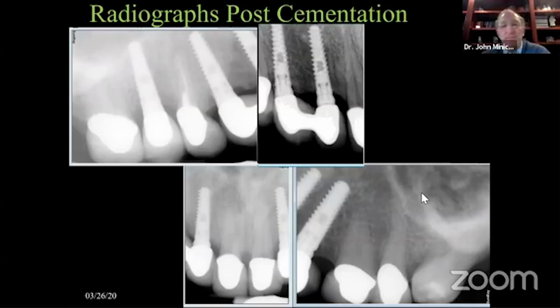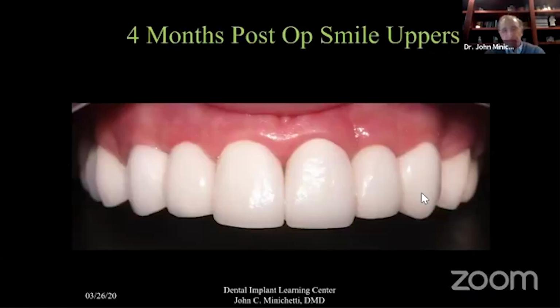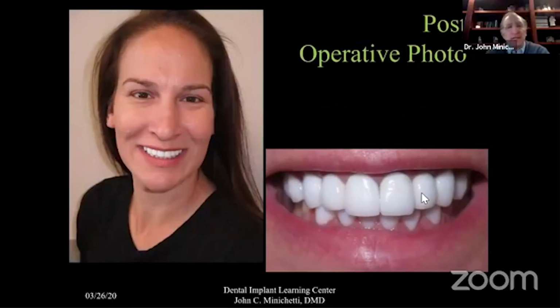And we use cementable crowns on these abutments. And there's a final outlook probably a few months later, 4 months later. And that's the final prosthetic result. And to be honest, the cost of this treatment ended up being a little bit more than what her husband's was, just when you start adding up the crowns.